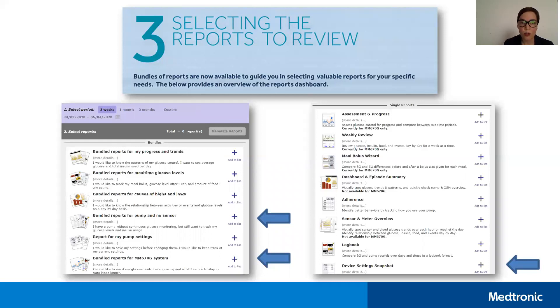Under the bundled reports, you'll find the single reports in case you want to look at a specific report only. One of the reports that we should all be aware of is the device setting snapshot. This is a good report to have on hand in case you ever needed to program all of your settings into a replacement pump, for instance. You'll want to select about two weeks of data at a time and then generate the reports.